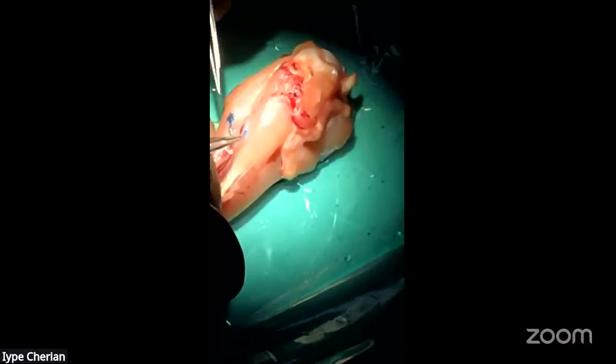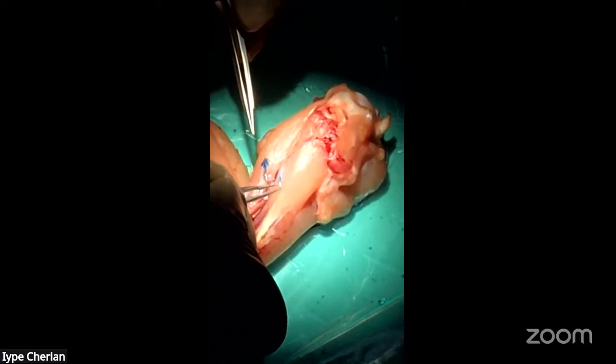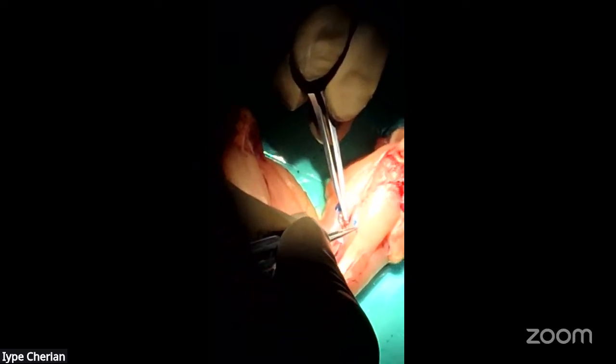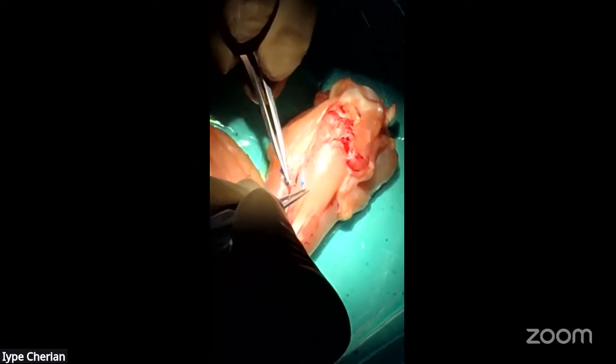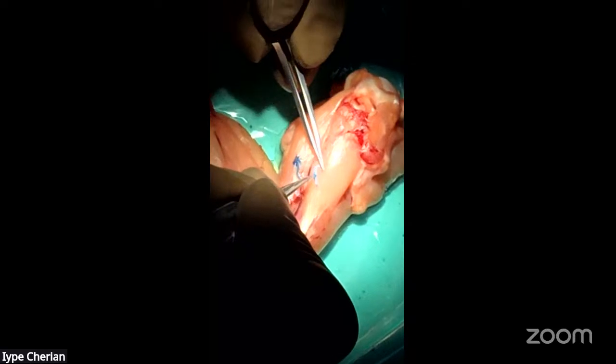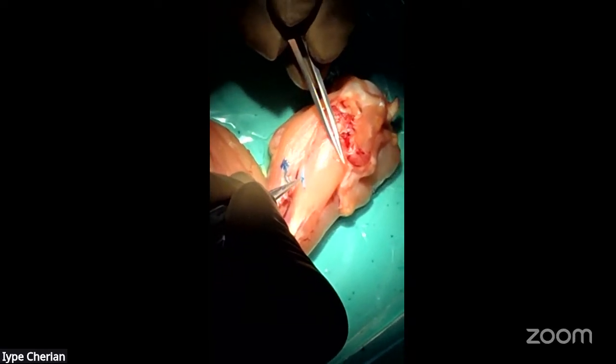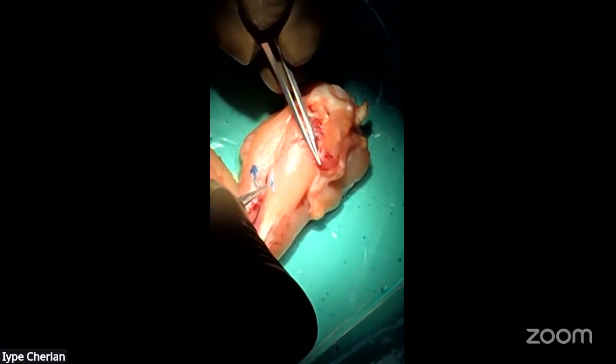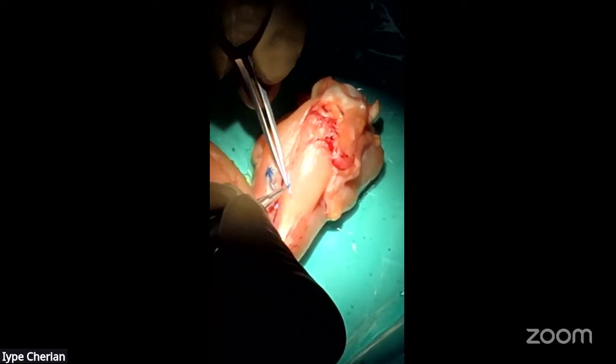So I'm doing a patch repair. It's a very, very small patch, maybe way less than a millimeter.